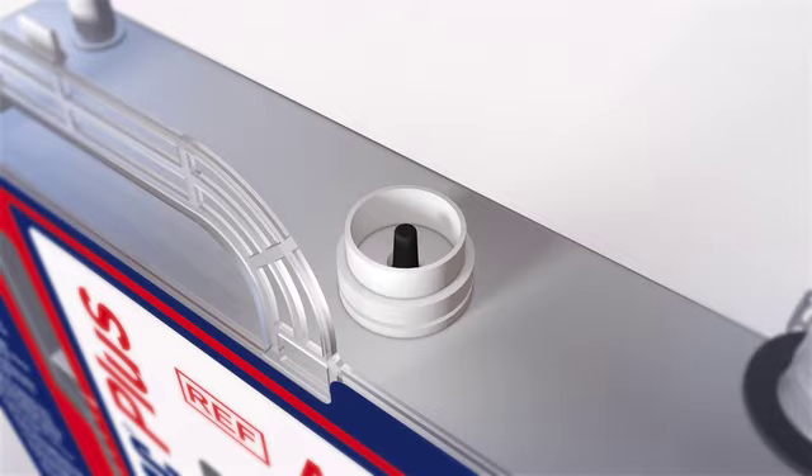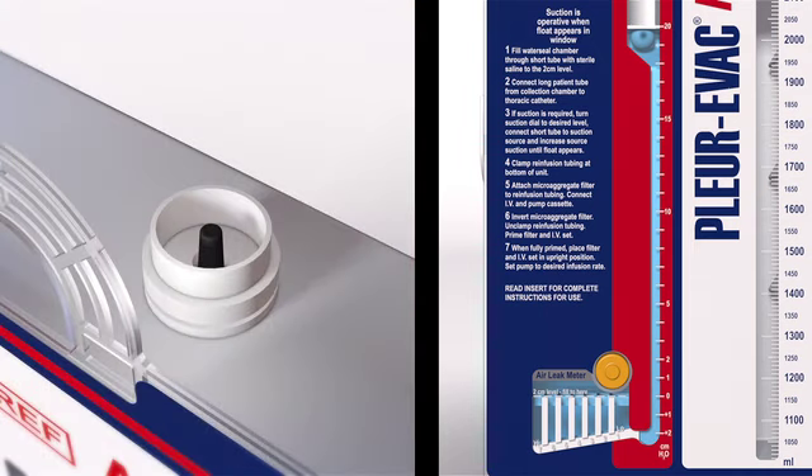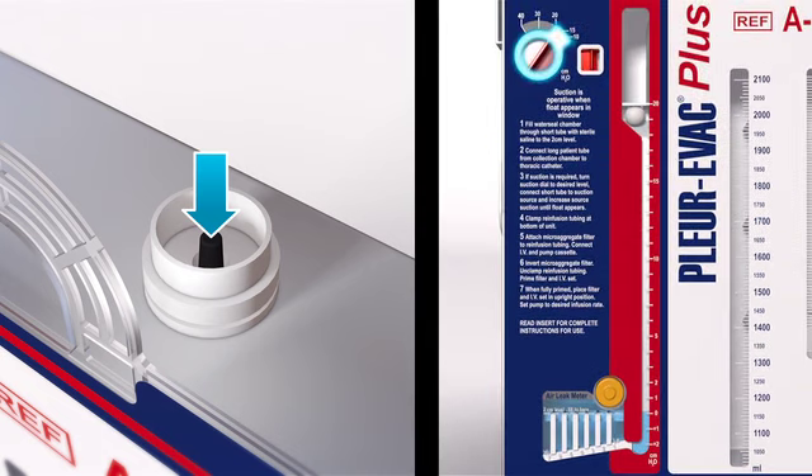For example, when turning the dial from a higher to a lower suction level setting, the water in the water seal will rise, indicating the patient's negative pressure remains at their originally imposed level, unless the patient has an air leak. To manually adjust the negativity to the new setting, depress the manual filtered high negativity relief valve. Observe the water level in the water seal chamber drop until it reaches the desired level, being sure not to let it drop below zero. By depressing the valve, filtered air enters the unit. Now the patient negativity is at the new lower level as set on the suction control dial.